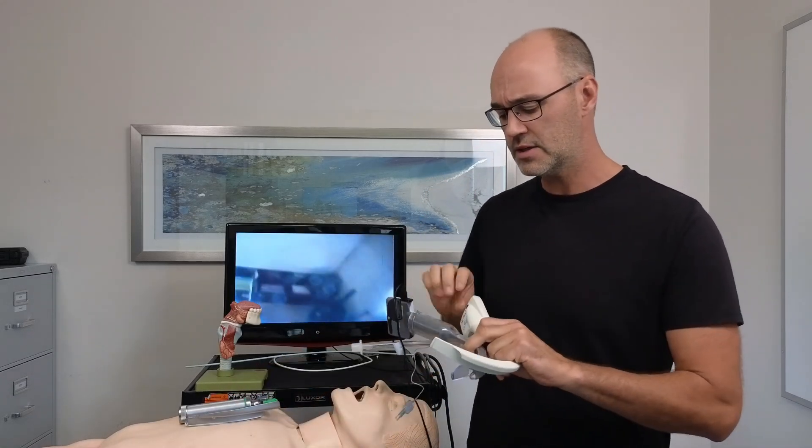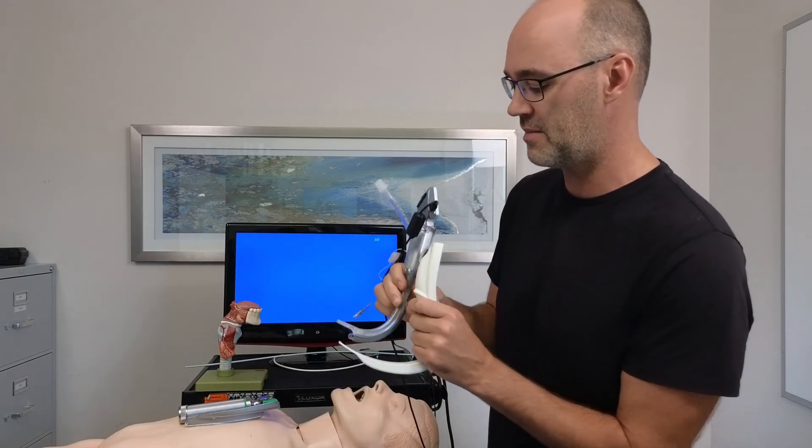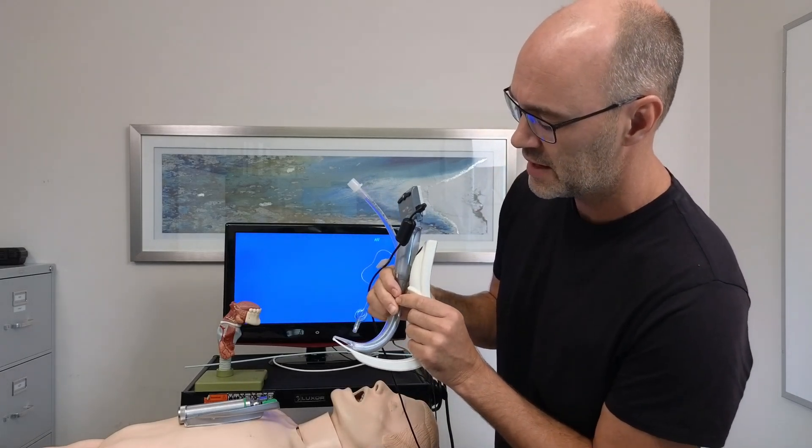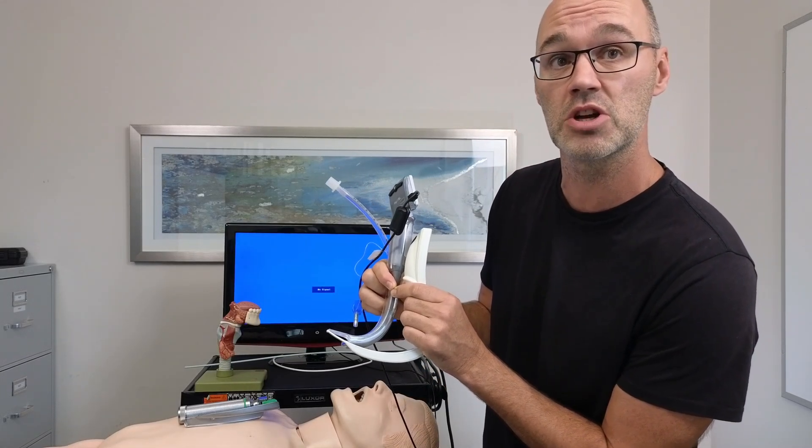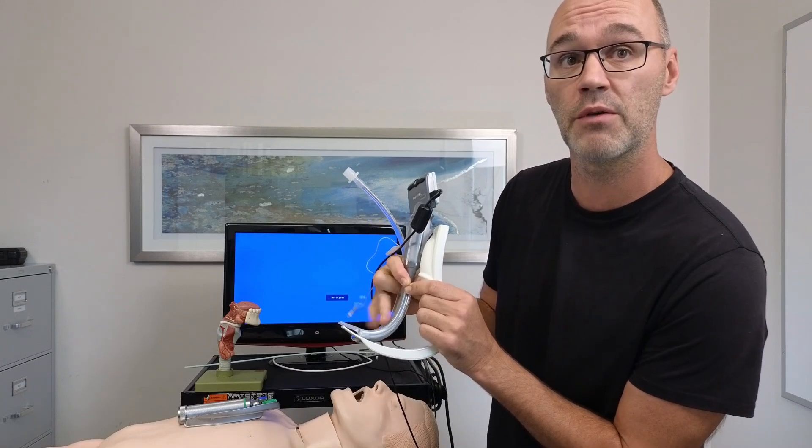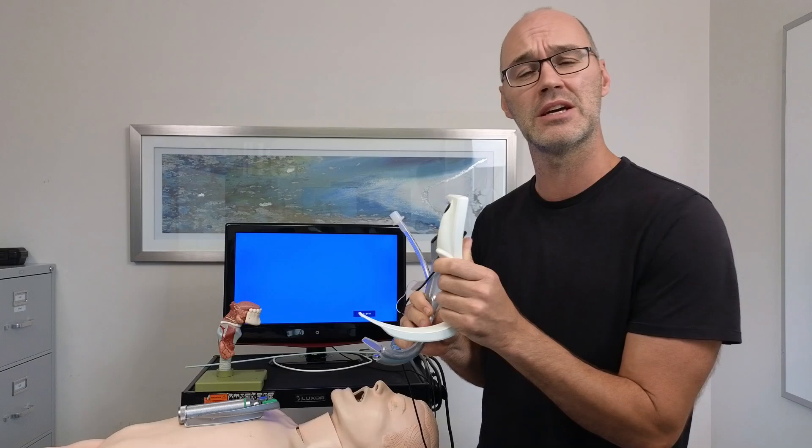Compared to the hyperangulated, if we compare these to hyperangulated, you can see how those, from the tip that goes in the patient's mouth, how those are very different laryngoscope blades. This is referred to as a hyperacute angle, and this would be referred to as a Macintosh style.